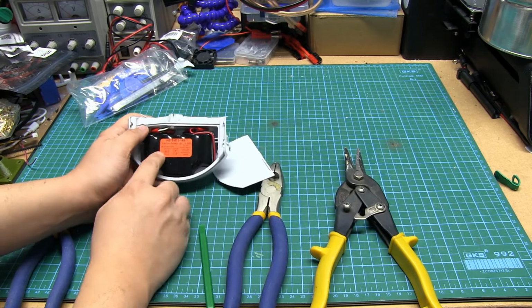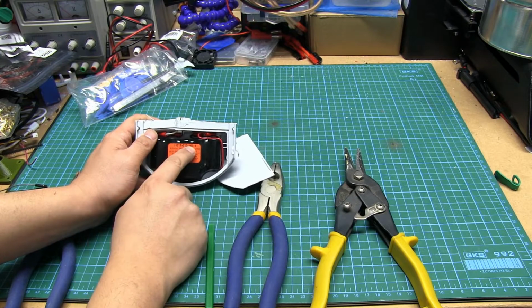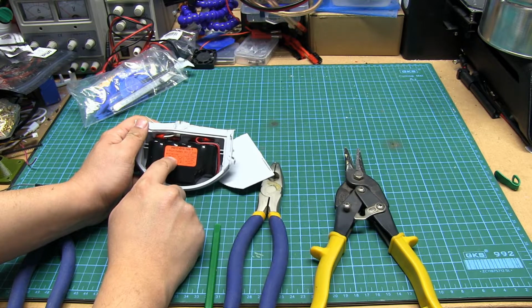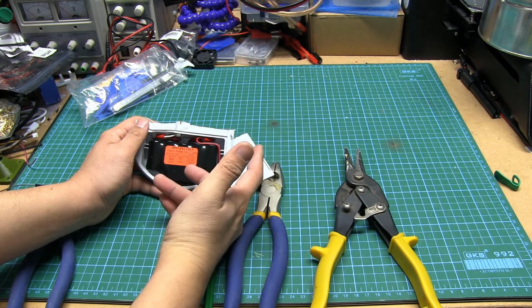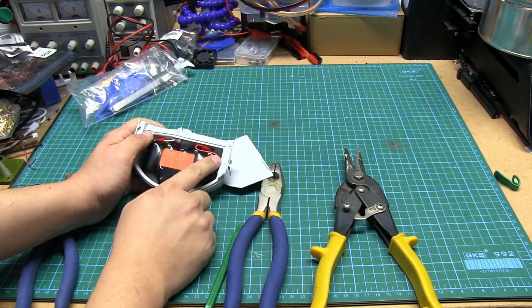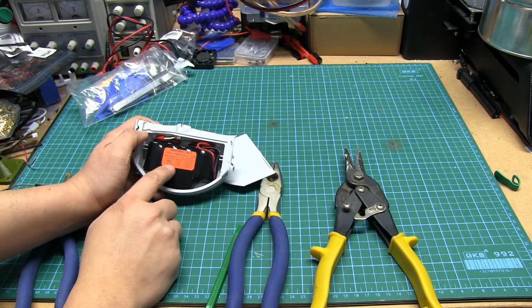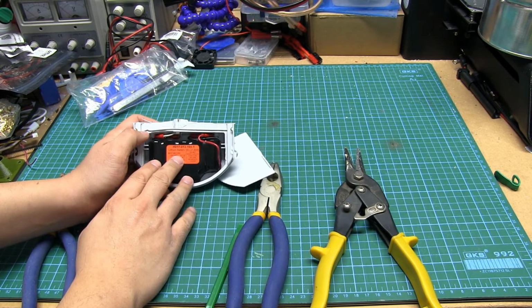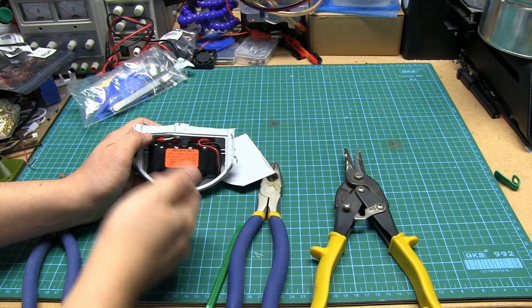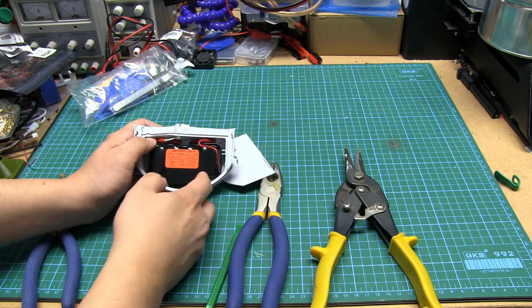Alright, so we have a part number here, H017-013-169, nice, -1. Lithium battery, best before July of 21. As I'm filming it, it's Jan 21, so there's actually some life left on these batteries. They've probably certified it such that they don't want to have the batteries expire prematurely, so they probably just derate them. Plus, these batteries are constantly drawn on for a very short period of time. The defibrillator boots up, does a self-check, and then powers back off without charging the capacitor.